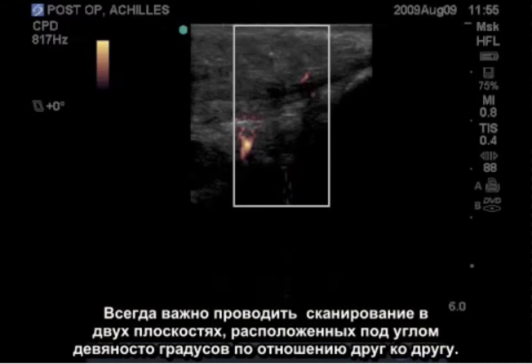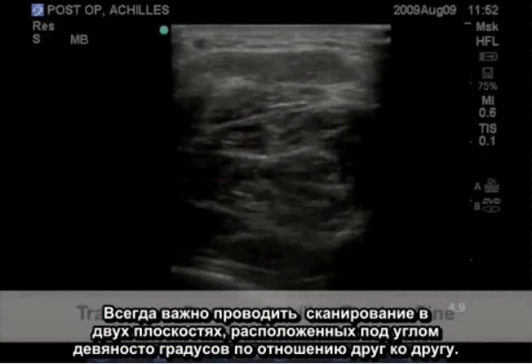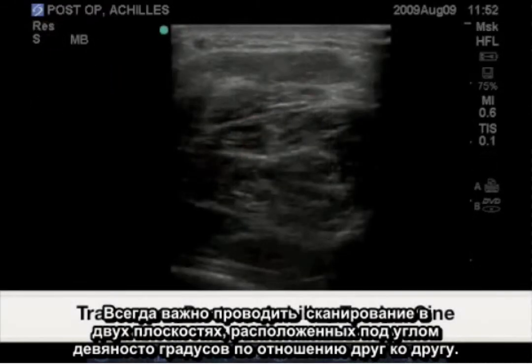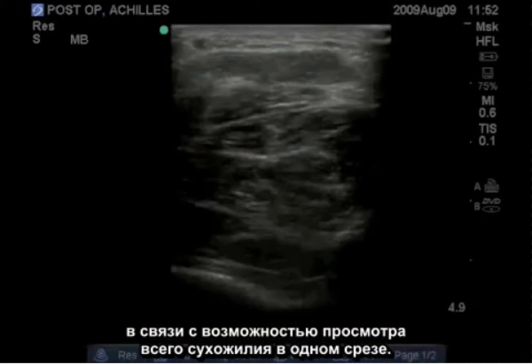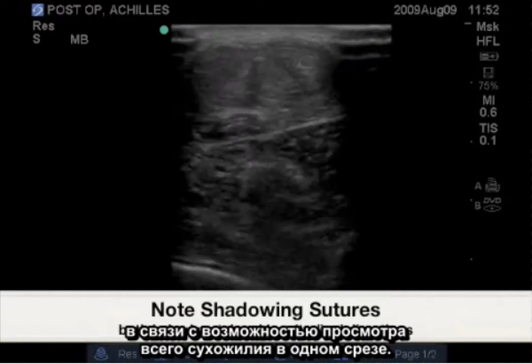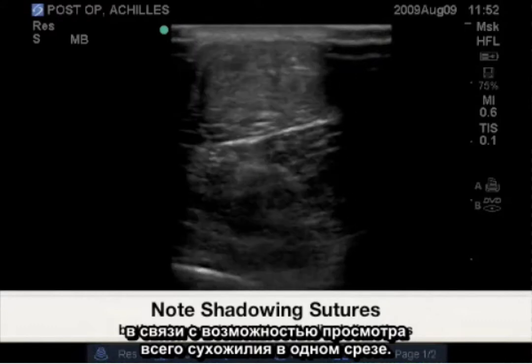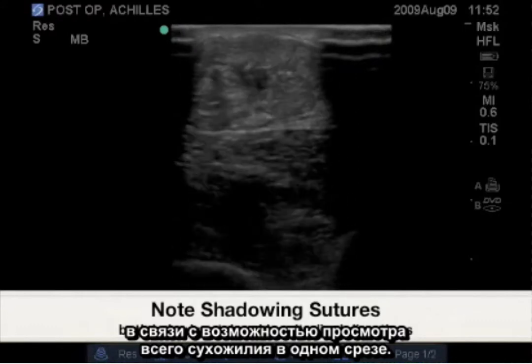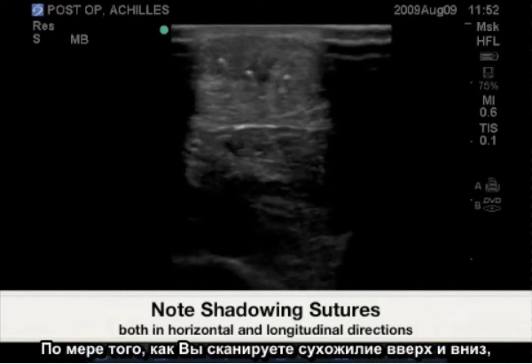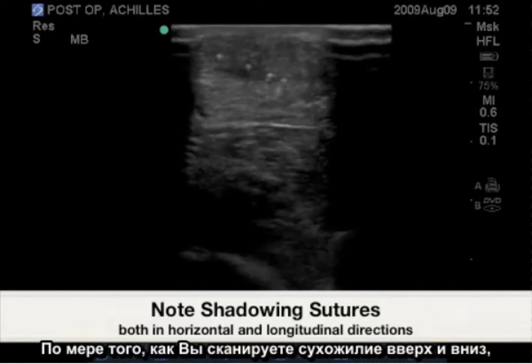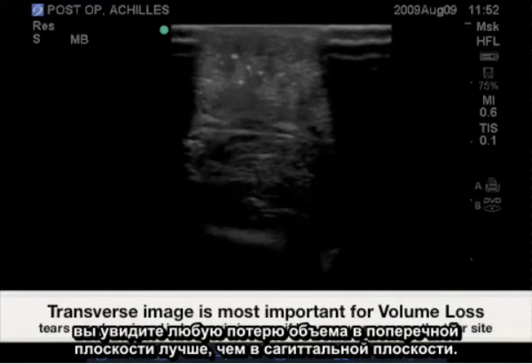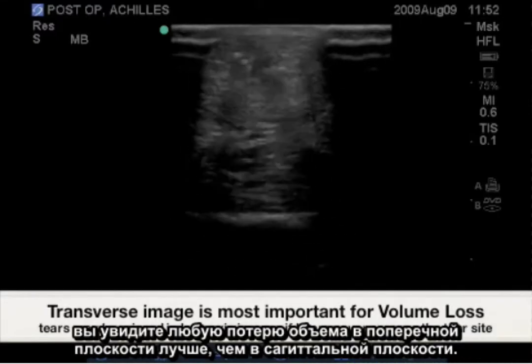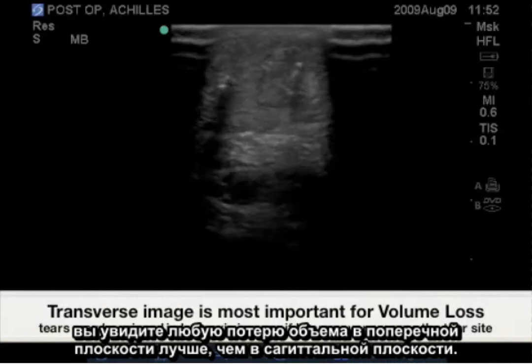Scanning in two planes 90 degrees from each other is always important. The transverse plane is more important due to the ability to view the entire tendon in one slice. As you scan up and down the tendon, we will see any volume loss in the transverse plane better than in the sagittal plane.